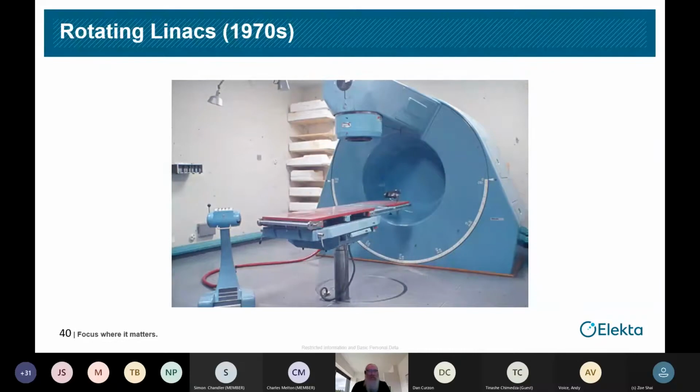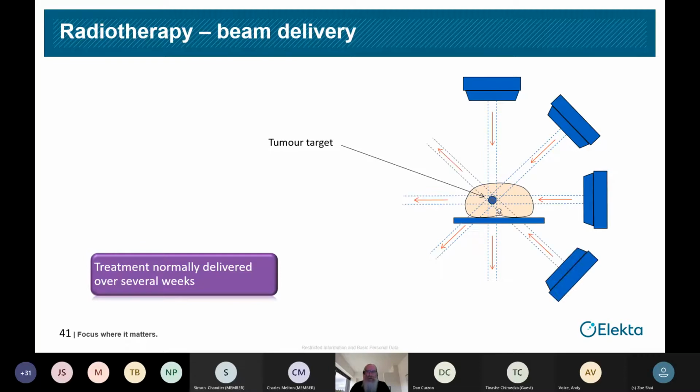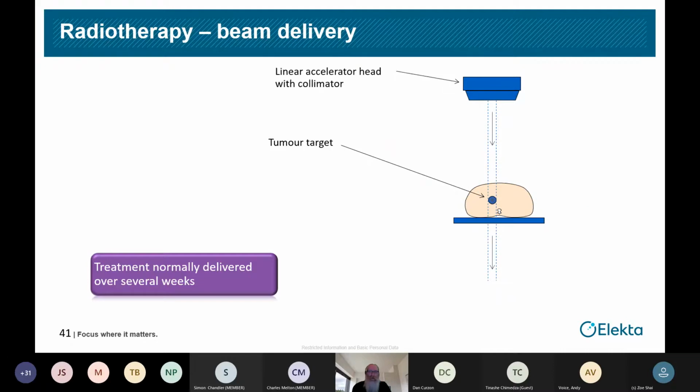This is one of our machines from the late 60s, early 70s. We have a cavity linear accelerator in there, and then bend the radiation beam. The radiation comes out here, and like those early machines, it's now small enough that we can make the thing rotate so that we can shoot the radiation beam from all around the patient. That's important because, as you see here, you've got the tumor. If you just shoot a beam straight through, you're giving as much radiation to the healthy tissue in front and behind as to the tumor. If you shoot from all these different angles, you get a concentrated radiation dose in the tumor and a dispersed, lower intensity radiation dose to the rest of the body.